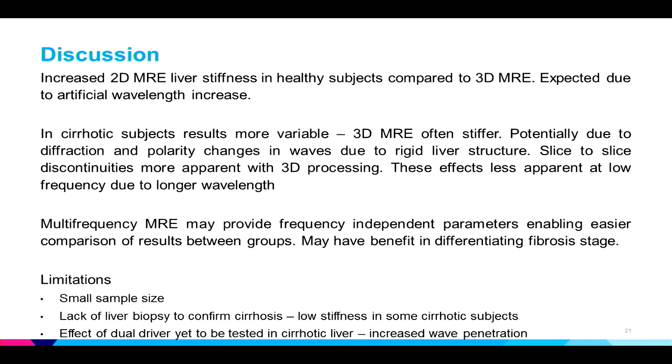Multifrequency MRE may provide frequency-independent parameters, which would be great because the stiffness changes depending on what frequency you're looking at, but it takes longer to do, so we don't know if that's going to fly, but it's something we really want to look at, even as a research application.